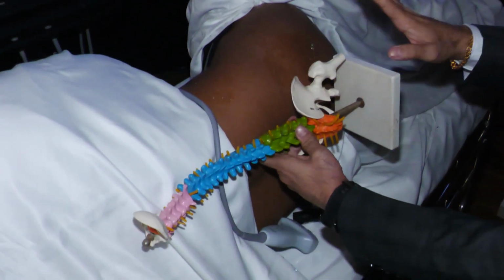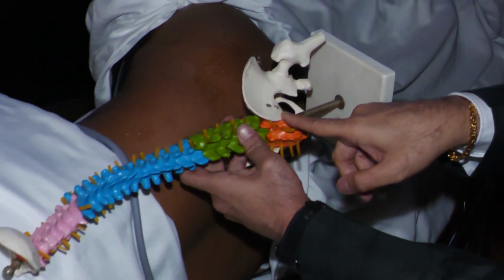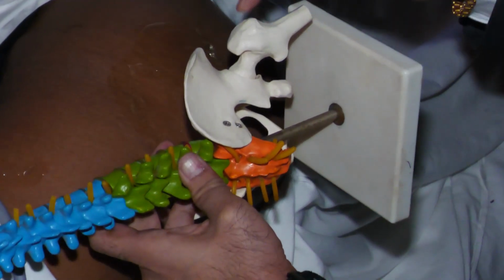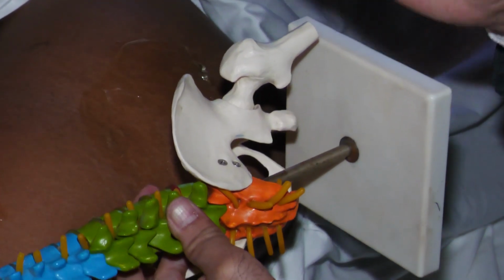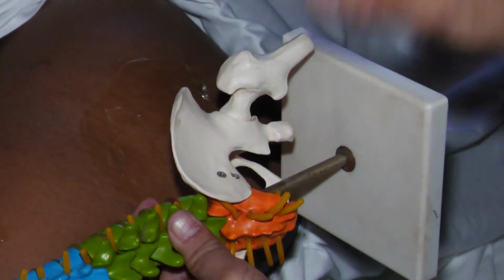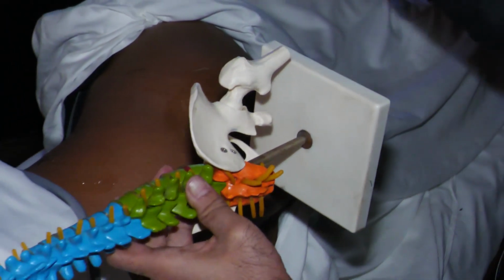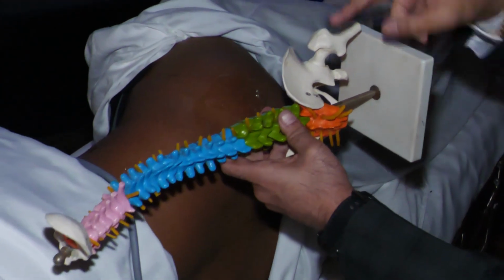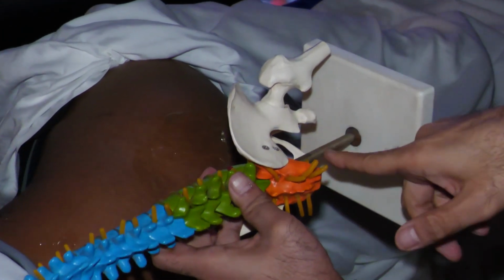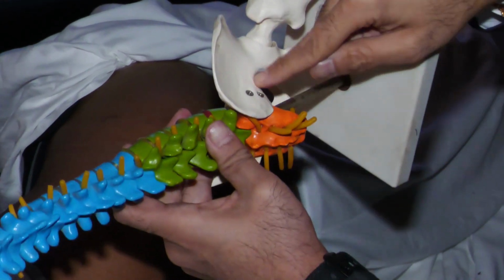So the individual is lying like this. The pelvis model is okay to you. You can visualize. So what is this point? Superior iliac spine. What is this? GT. If I draw a line and bisect it, medial to the bisection point, if I keep my probe medially, what is that approach? Parasacral parallel shift approach described by Bernstein et al. I'll visualize the ala of the ilium, 3 muscles, again move downward towards the midline. I'll visualize the break. What is that break? Greater sciatic notch.